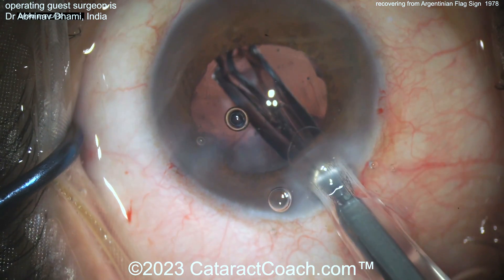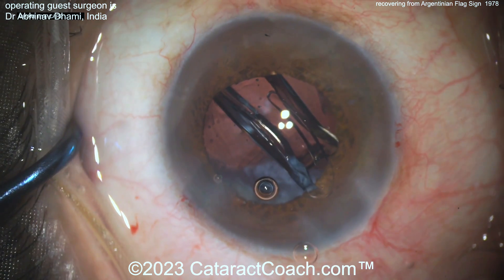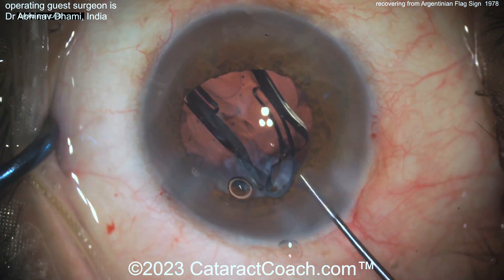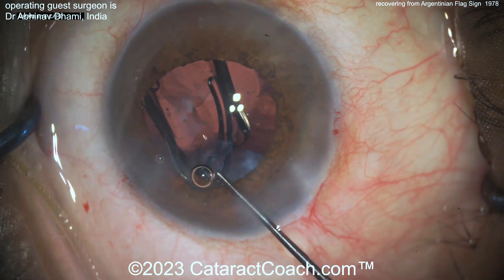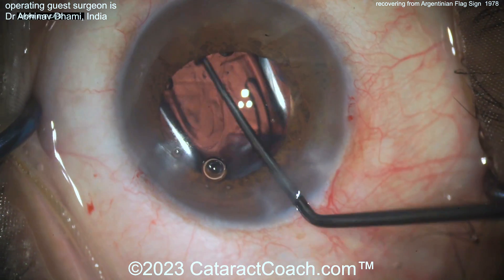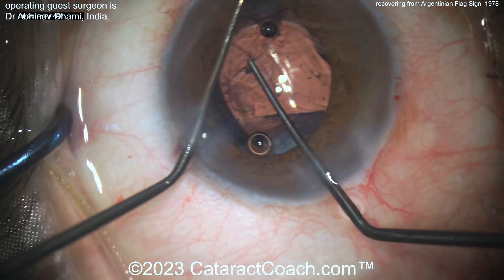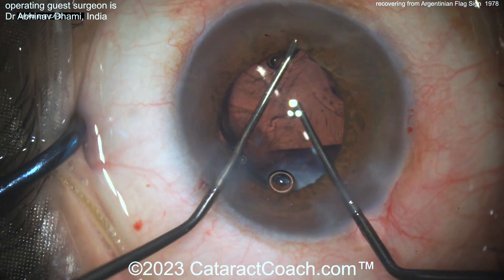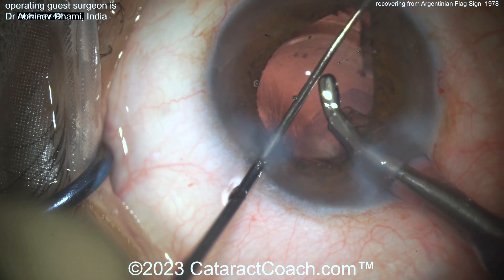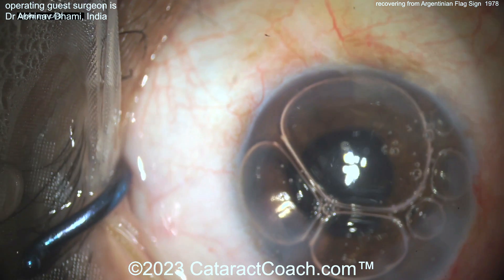By some miracle, that bag is intact! Luck is on our side today. Here comes the lens — make sure the lens gets in the bag. Remember, sub-incisionally you had the rhexis that was still too wide and too big, so make sure you get this all the way in there. Don't stress out the bag — you can still break it. You may want to trim up the rest of that capsule in the sub-incisional space. Double-check that the lens is in the bag and not in the sulcus; that's critically important. Wow, this is a stressful case. We all learned our lesson: we need to approach these cataracts with caution.